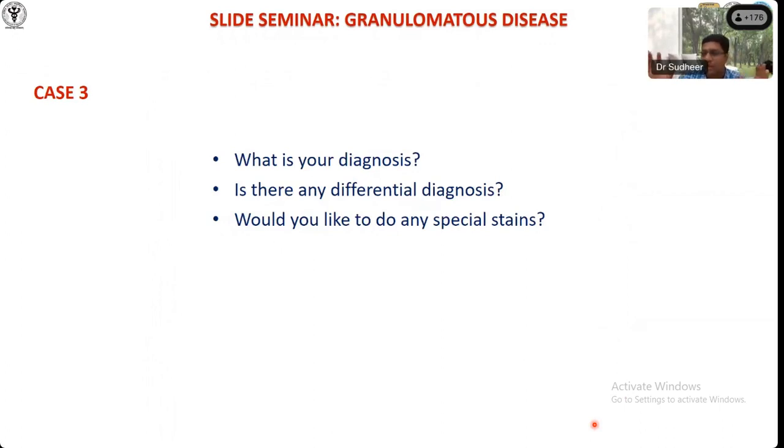Yes, you found granuloma. There are multiple granulomas. Some of them, you said, are becoming confluent, no necrosis. What do you think, and how do you go about this kind of case? Sir, I think it's a case of sarcoidosis, sir. You will give a definitive diagnosis of sarcoidosis? Sir, multi-system involvement, sir. What will you do next in this case?